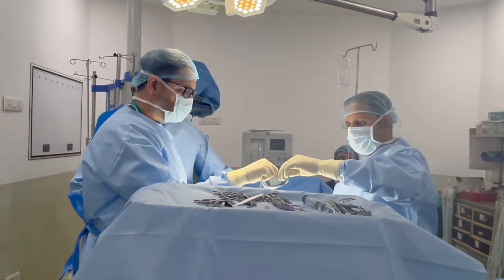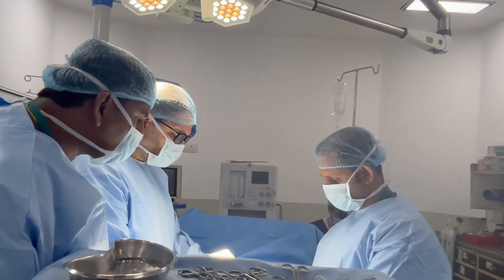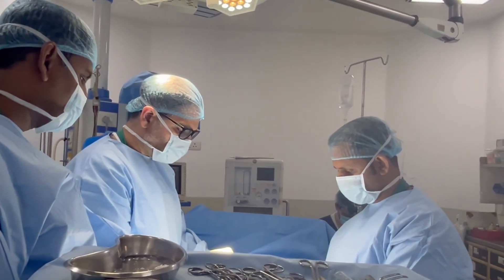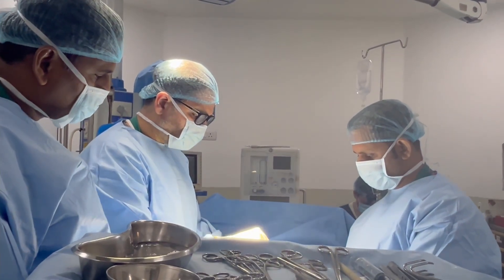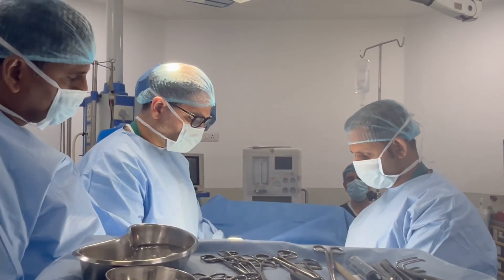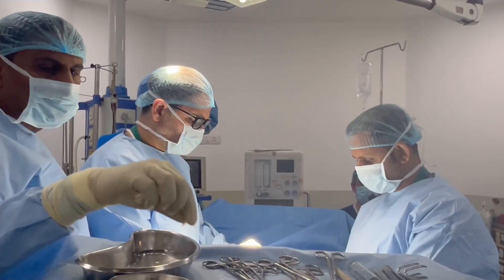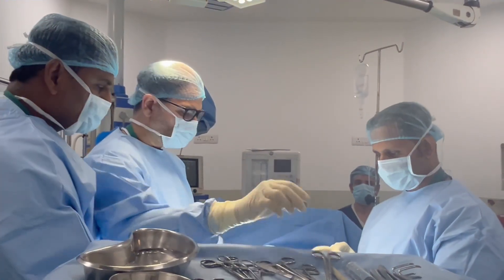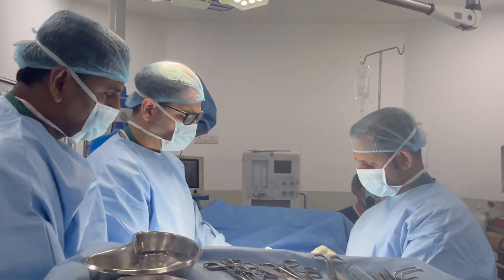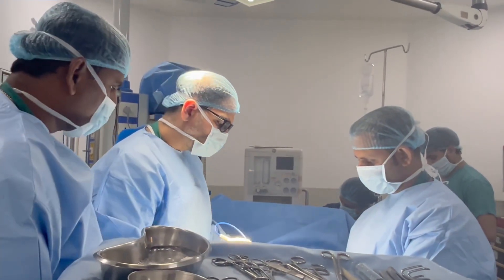After artificial erection, we apply a catheter. We use a horizontal penoscrotal incision. We used to use a longer incision, but we saw that the exposure was not so good and sometimes the scrotum would open during surgery on the penis. So we started giving a horizontal penoscrotal incision — the scrotum doesn't open and the exposure is good.